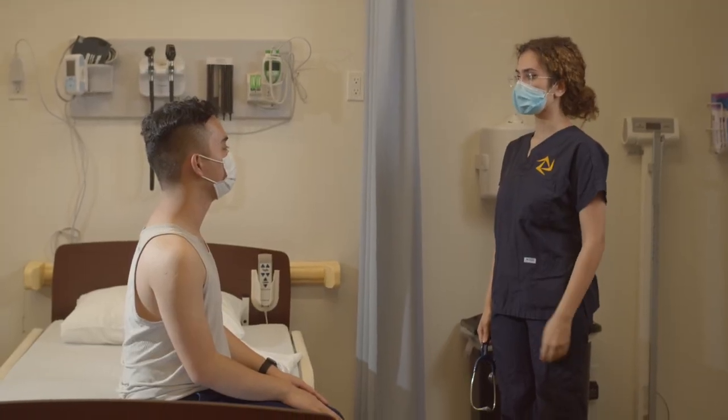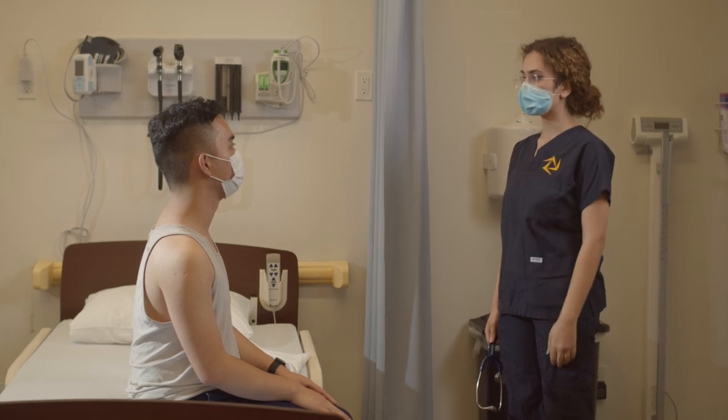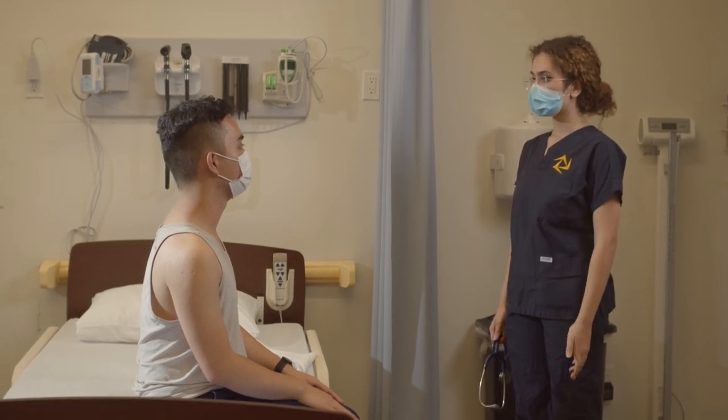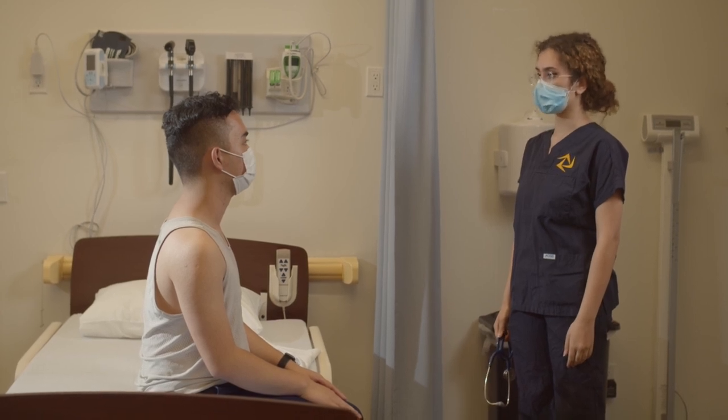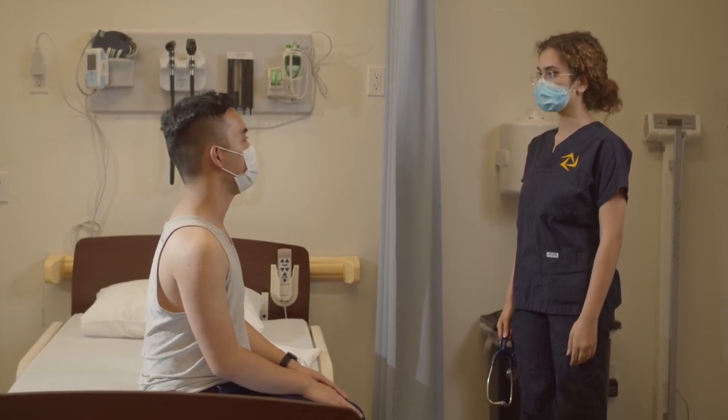I need to auscultate your lungs on the front side here. I have to listen on bare skin. I'll provide you a drape, but it'll involve exposing some elements of your chest, but your breasts will be covered at all times. Is that okay? Yes.